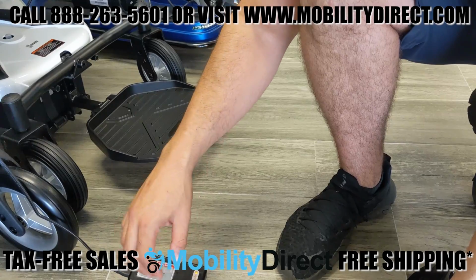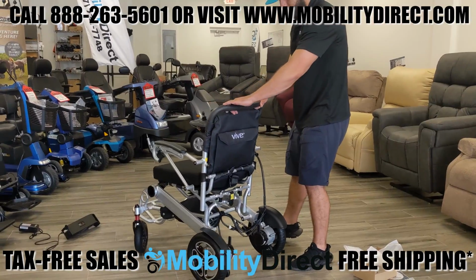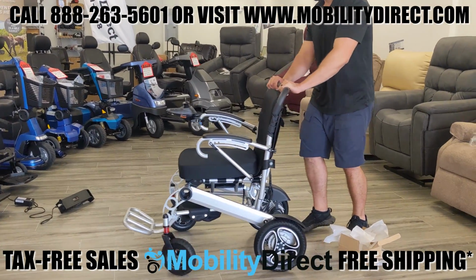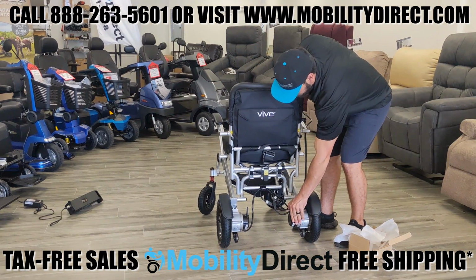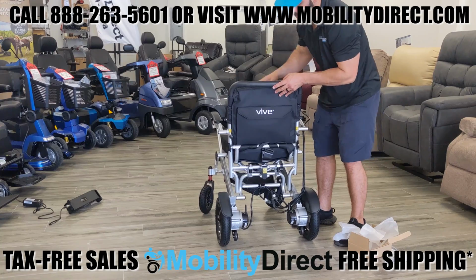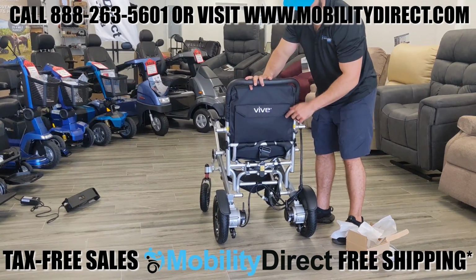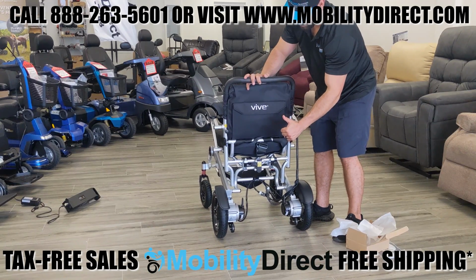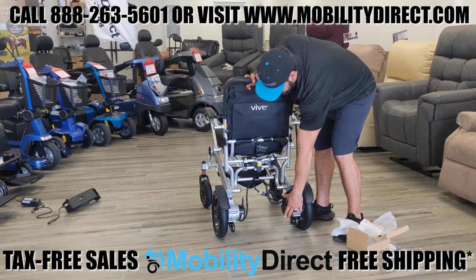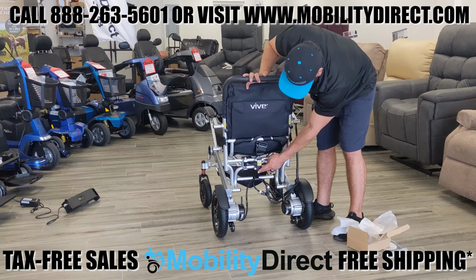Now we're going to demonstrate a few things for you, such as the electromagnetic braking system, which is off right now. Those two levers that I'm working with allow you to lock the chair into place by engaging the electromagnetic brakes. The joystick controller will not work unless the electromagnetic brakes are on. So if you need to freewheel somebody, you can turn them off.